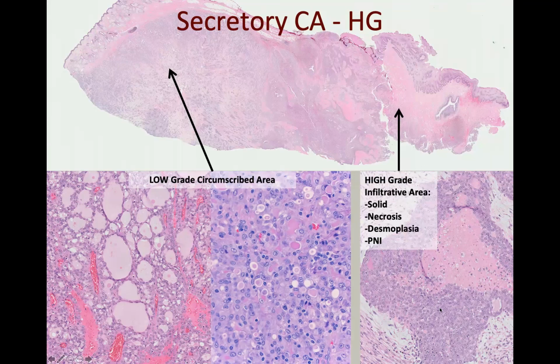So things we like to think about that repeat over and over again in salivary tumors that are high-grade are things like perineural invasion, lymphovascular invasion, necrosis, right? So anytime you see any of those things in a salivary tumor, just consider that it may be a high-grade tumor.